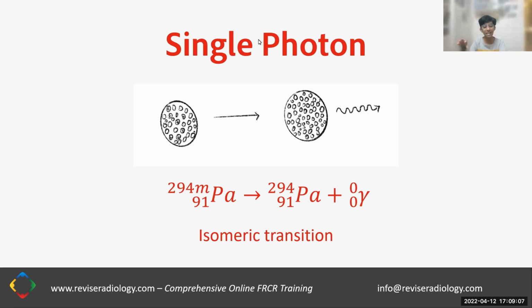So when the radiopharmaceutical is in the patient's body and the radiation is being emitted, the fundamental physical process emitting this radiation is the one you have on the screen in front of you. The important thing to note is that the radiation is in the form of a gamma photon, which doesn't have mass or charge.